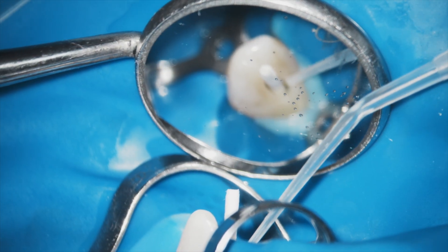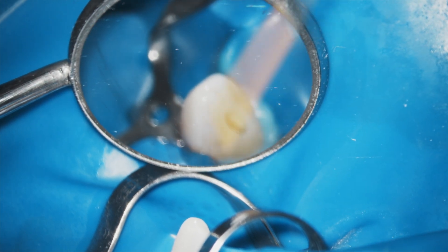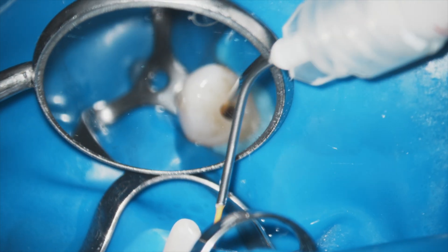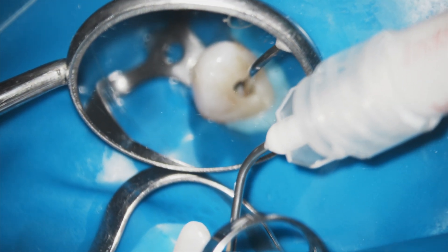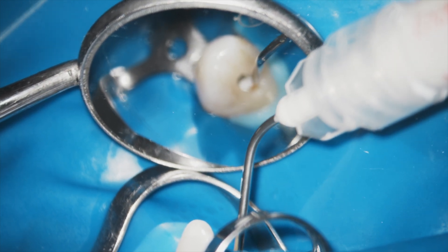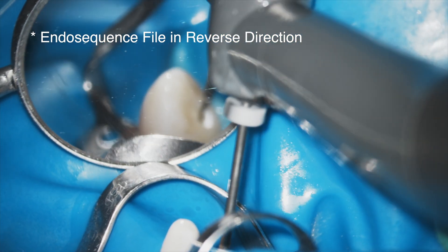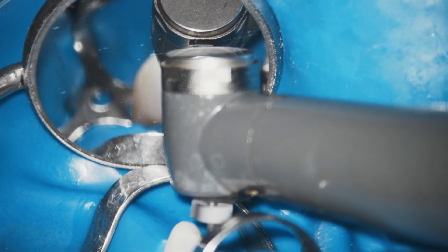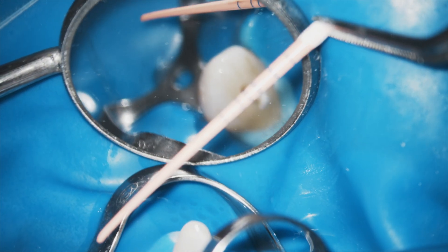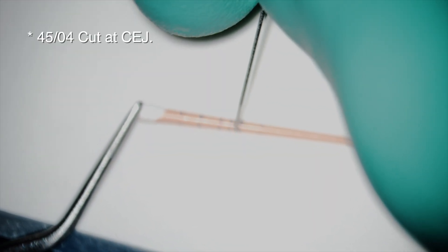You can see how the Total Vac is used to dry the canal, then we add a paper point with some air to wick out the solutions. Now I'm using the EndoSequence BC High Flow, which has a slightly higher radio-opacity, to place a little sealer in the coronal two-thirds of the root. Then using the original size 20 file — clean and disinfected with a little hypochlorite — I run it in reverse direction a millimeter short to coat the canal walls adequately. This variation of the hydraulic condensation technique I described back in 2008.